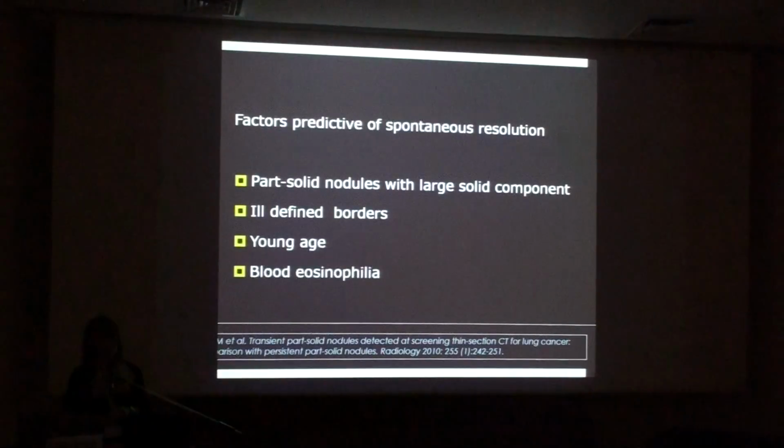Yes, but again, it's a matter of debate. For some authors, it's true if the lesion is less than 3 centimeters, and for others, there's a cutoff for pure ground glass above 16 millimeter, where it can be a minimally invasive adenocarcinoma. But, for instance, in the Nelson study, a pure ground glass nodule, whatever its size, is considered to be a negative screening.